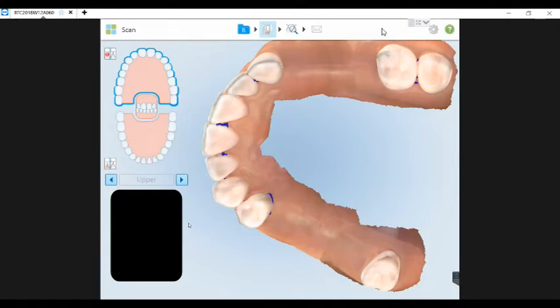So those are a couple things that I have had success with. Again, that's not an iTero sanctioned recommendation. They sort of think I'm crazy when I do that. But it slows me down because I'm trying to follow the path that I drew with the Dr. Thompson stick. And in slowing me down, it allows the images to stitch together on the scanner itself.